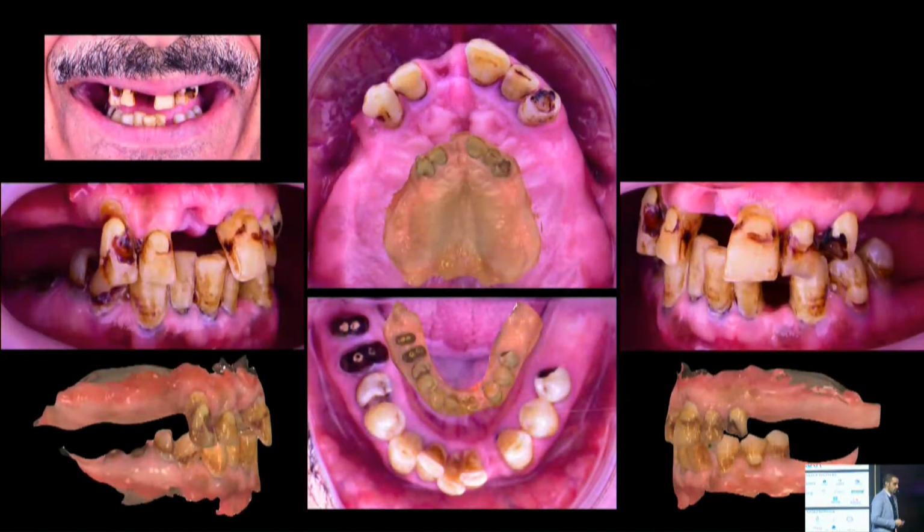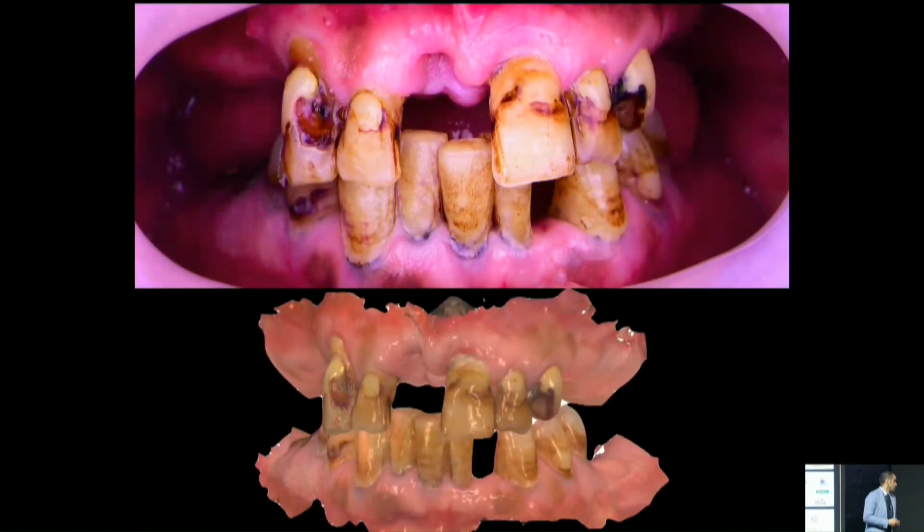So we went ahead with our intraoral scanning. I also supplemented my 2-dimensional photos with 3-dimensional images from the 3D facial scanners. Now, the concept of this is nice because we can import and merge our data from our intraoral digital wax-ups into those scanners and have more of a dynamic evaluation of the case, at least by concept. I will be challenging this concept in later slides and provide an overview of what the literature has to say about this.